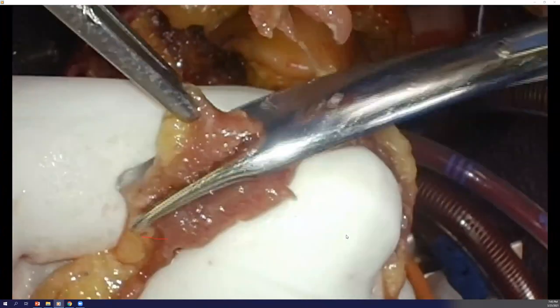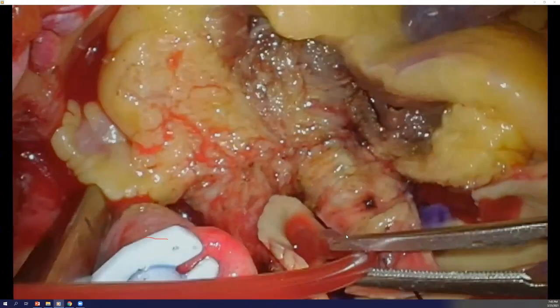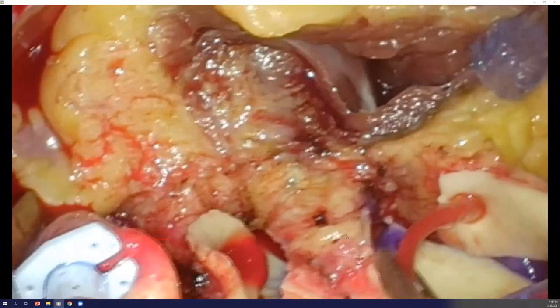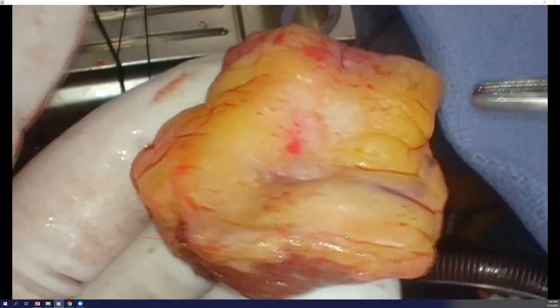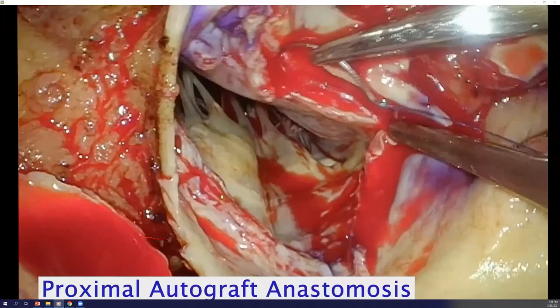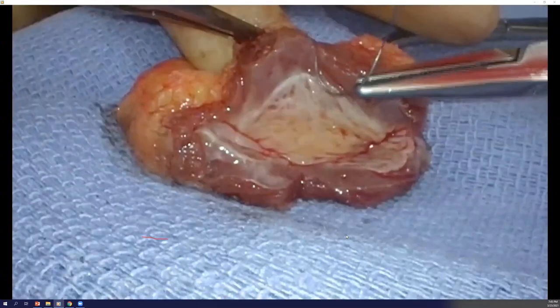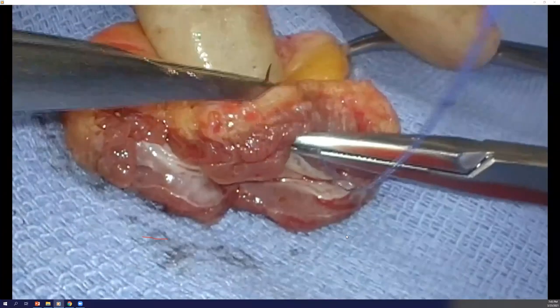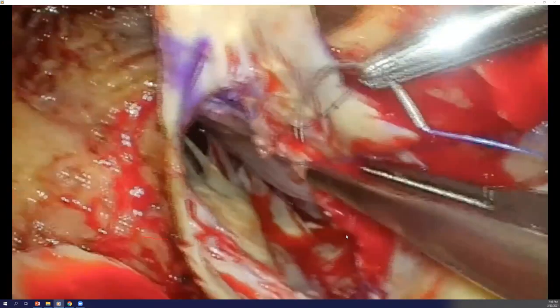So once we've done that, we then implant it on the aortic side. But before we do so, I just give a bit of plegia through the coronaries to make sure that our resection plane here has no bleeders that we should fix right away. Here is the orientation. We keep the thicker part anterior and the thinner part posterior. I use interrupted single 4-0 Prolene sutures. And the main principle is to exclude this muscle under the insertion of the pulmonary cusp and to really try to sit the valve in an infra-annular position.